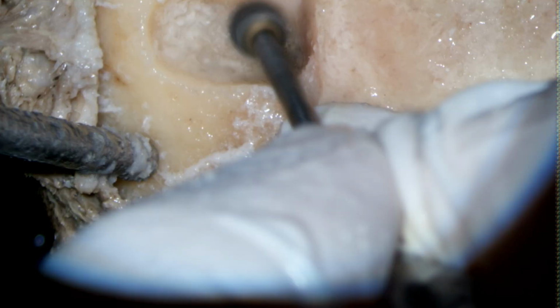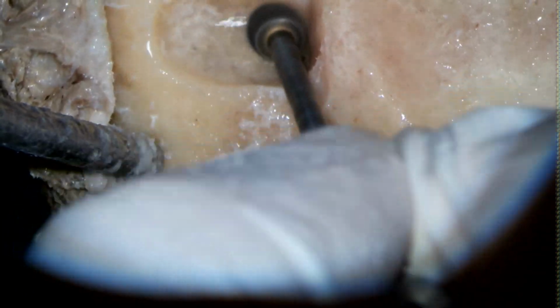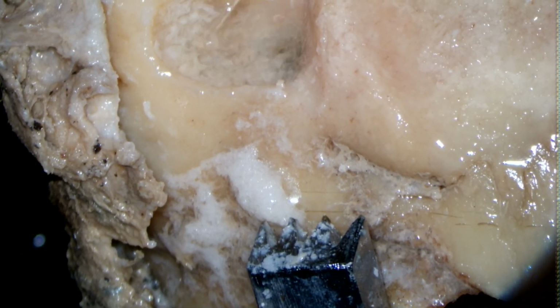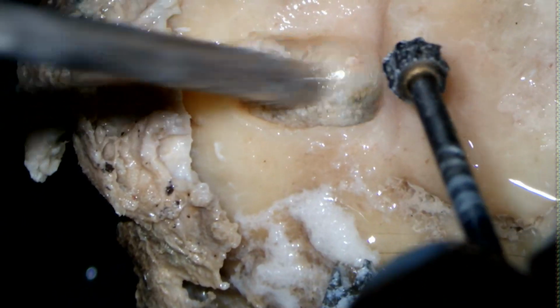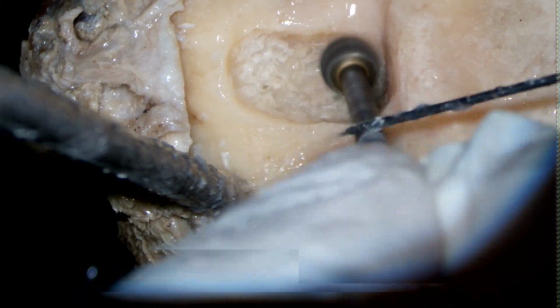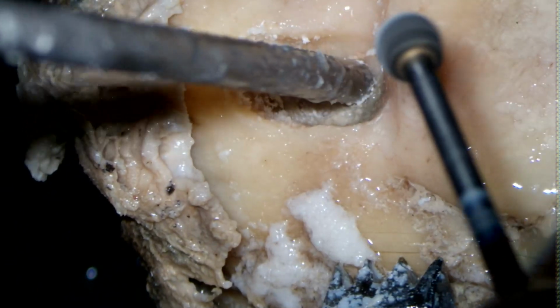So even if you actually open the dural plate or the sinus plate, it doesn't have much problem, but you should not be damaging the facial nerve, because in the contracted antrum, when you are drilling, the size of the antrum is very small, and you tend to go anteriorly and can damage the second genu of the facial nerve or the vertical part of the facial nerve. So it is important that you remain superiorly and posteriorly.